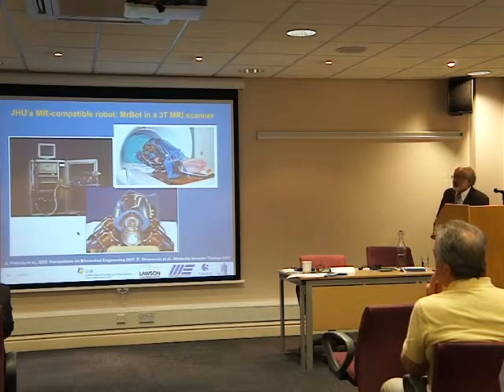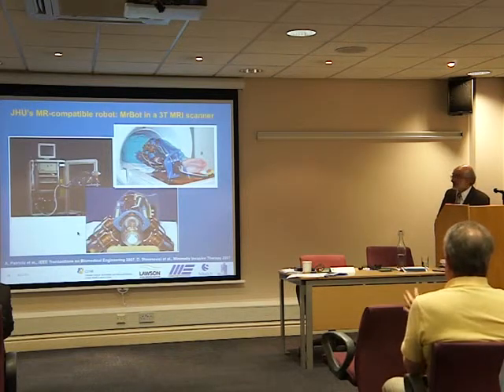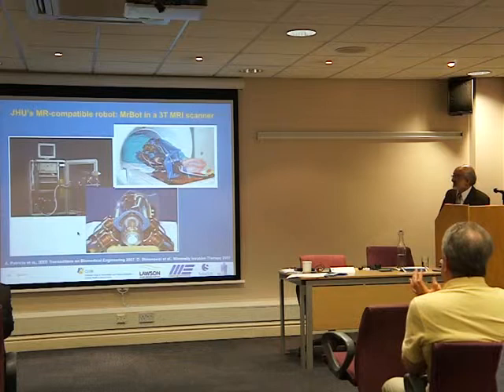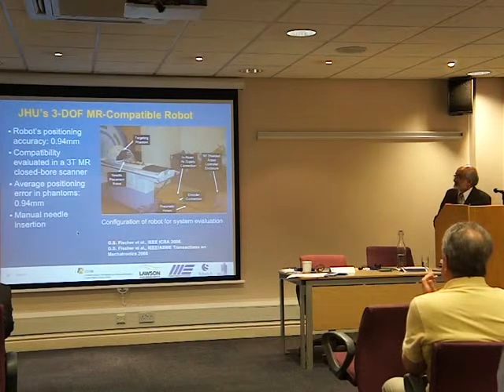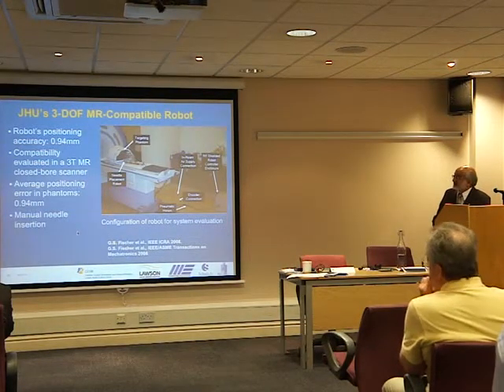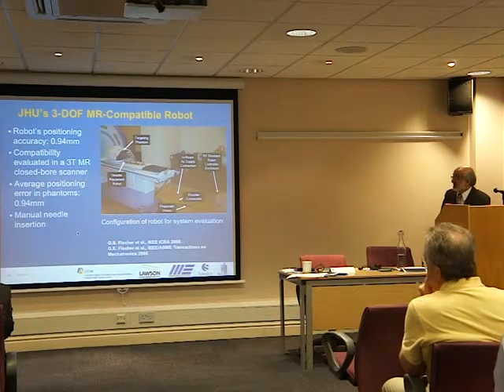The robot has pneumatic drives. Almost everything that would create a problem in the MR has been eliminated, and the system has been designed so that it only uses non-magnetic materials, and motors are pneumatic. Anything that is magnetic is kept outside of the MR suite. This is another MR-compatible robot by a different group at Johns Hopkins, and once again, the accuracy is very high, but the application is limited to ORs that are equipped like this.